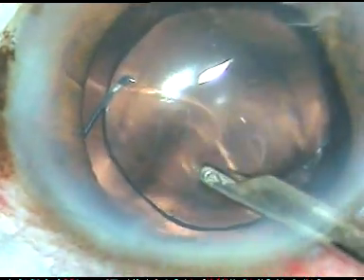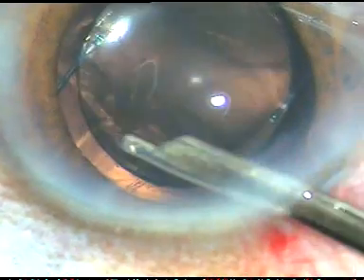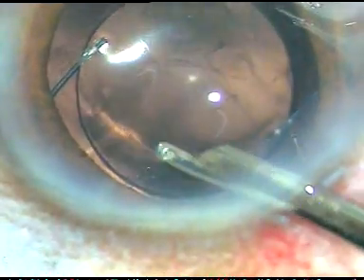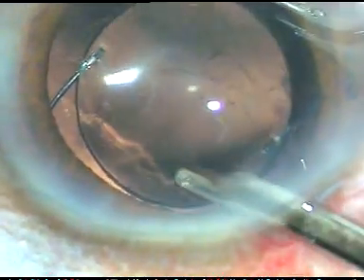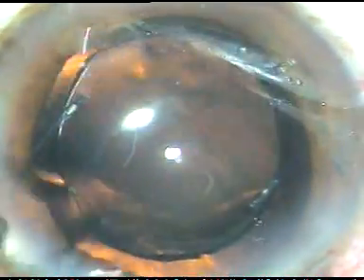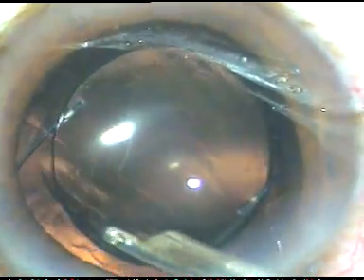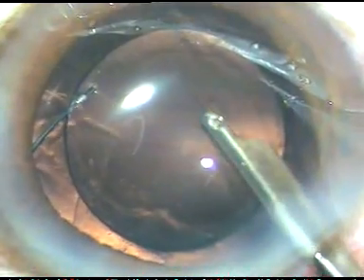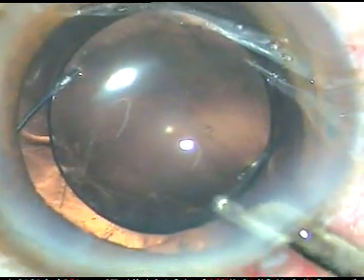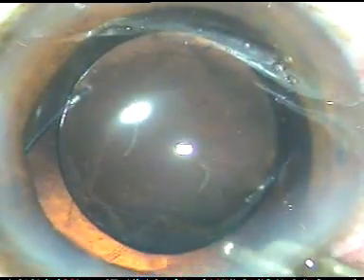And now I am going to remove the viscoelastic substance — that is Viscoat — from the anterior chamber. And the Viscoat is coming out nicely. Though I was quite sure that the anterior vitreous face is intact and it has not been disturbed, I confirmed it by using a bit of triamcinolone acetonide in this case. So I am removing all the Viscoat from the anterior chamber. And it is coming from behind the lens also — a lot of Viscoat is coming.